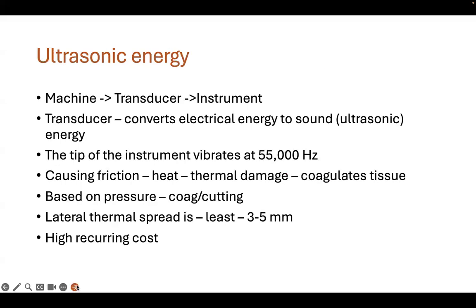And coming to the last energy source of the day, which is considered to be the most advanced as of now, is the ultrasonic energy. What you have to understand is that it is also similar to the bipolar, but there is a machine which has electrical energy, and in the interface you have got a transducer, which is usually called the handpiece. These transducers have crystals in them which convert the electrical energy to sound energy in the machine.